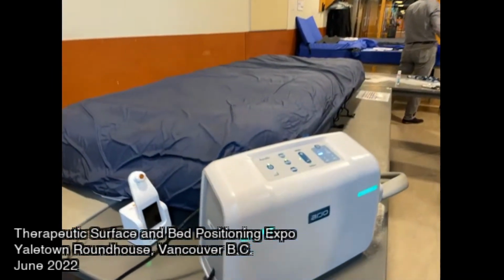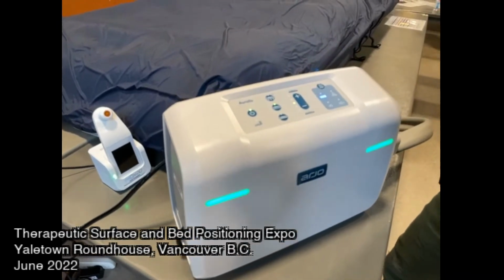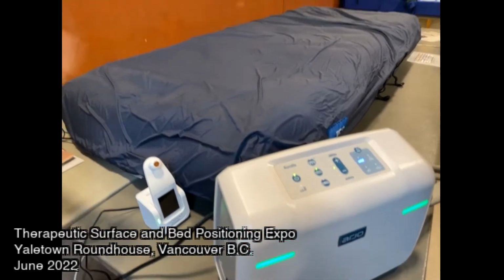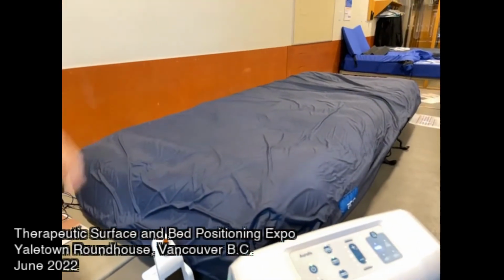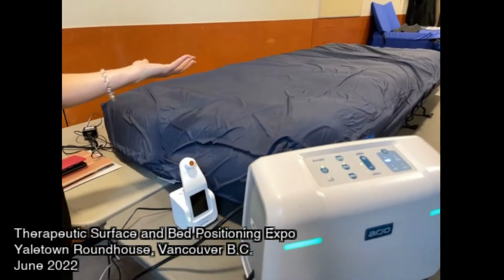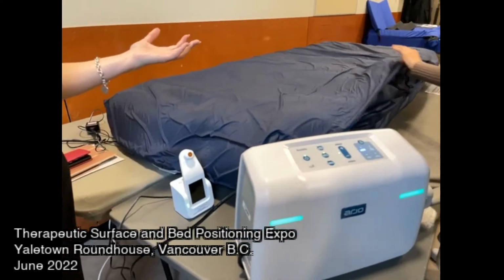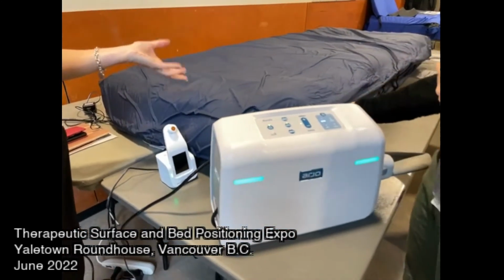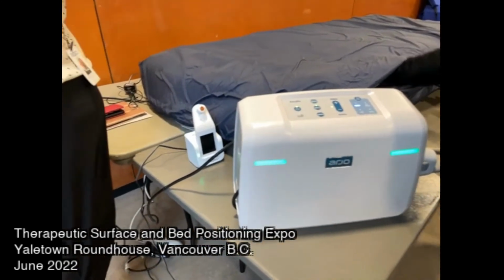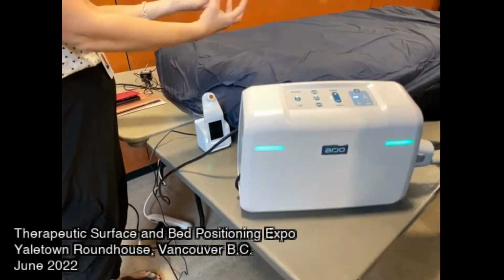So it's for perspiration as well as if someone's incontinent? Yes. Obviously you're still going to clean up every incontinence episode and use dry flow pads. There are air permeable pads essentially that you can use with a Skin IQ or low air loss. That's a combination that still allows the air to draw in the vapor.